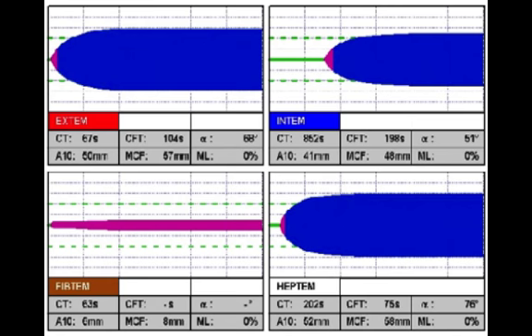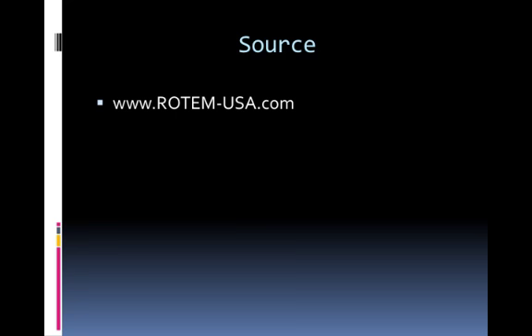So basically, this was just an overview of a device we're using to look at real-time clotting within the body compared to the previously used INR, PTT, the laboratory tests that were initially looked at more for hemophilia as well as Coumadin and following chronic medications. Exactly. So we got a lot of our sources from the ROTEM website. We've been using this a fair amount, predominantly with our trauma service here at the hospital. We have definitely gotten some interesting utility out of it.